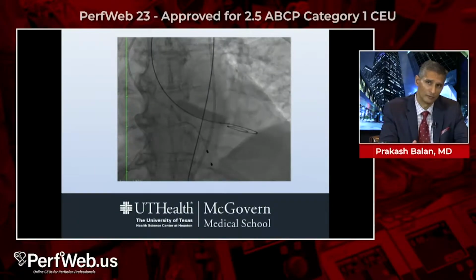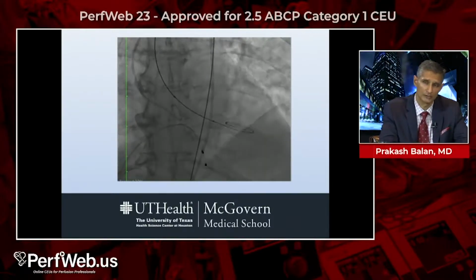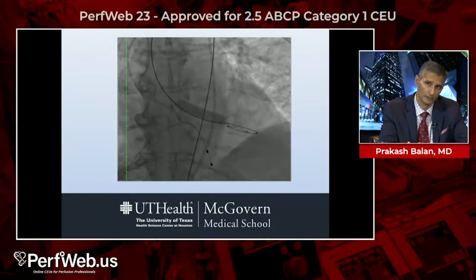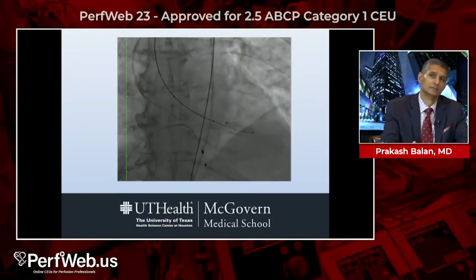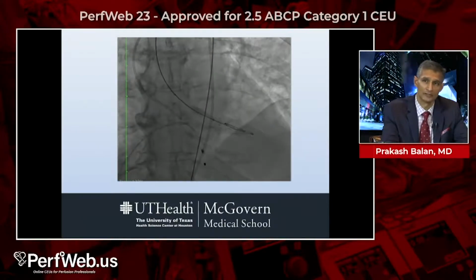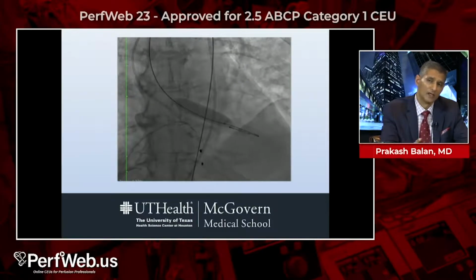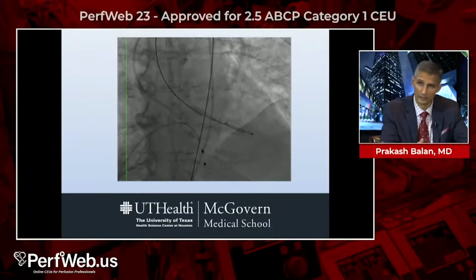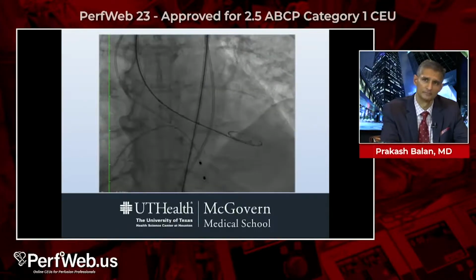Even a simple valvuloplasty balloon, a 20 millimeter valvuloplasty balloon, would not cross. So we actually took a 10 by 40 peripheral balloon and put that across the valve to create an initial valvuloplasty to serially dilate up to get our valve across. Immediately after this valvuloplasty, the patient fibrillated. One defibrillation, we got her back, and she was maintaining her pressure at that point.